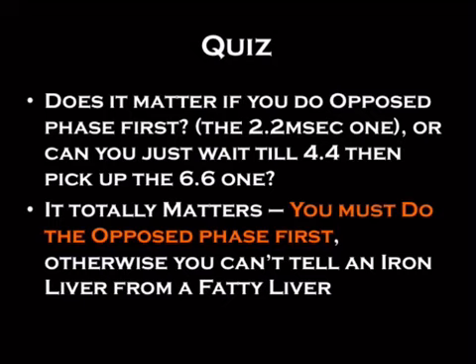And the way to remember that the opposed phase comes first is if you think about them on the track, he's going to end up 180 degrees across from him before he makes it all the way back around to lap him.